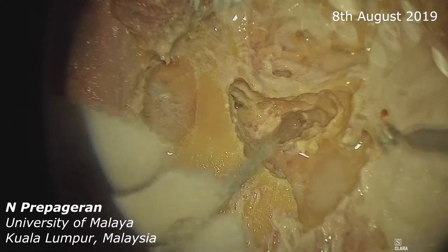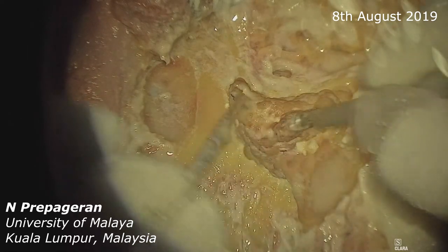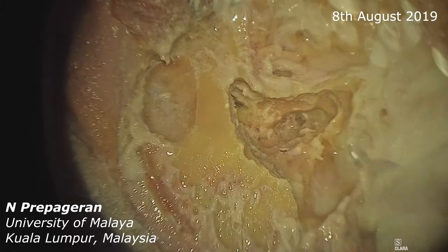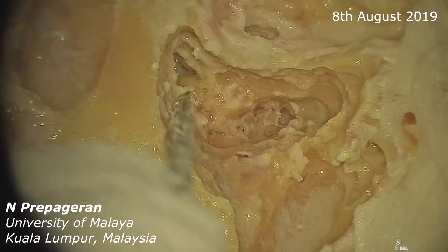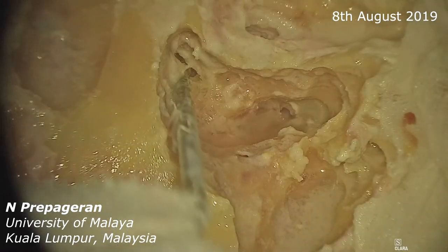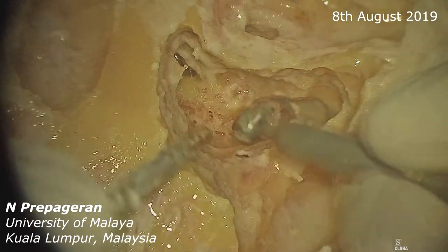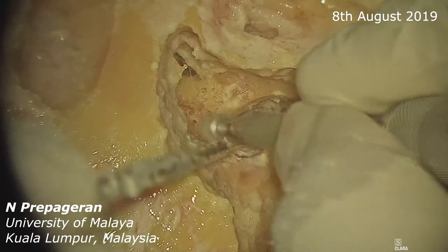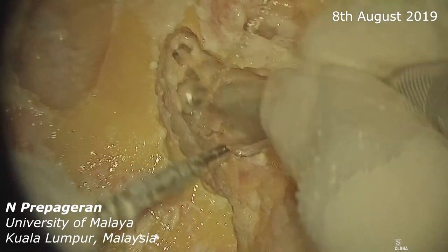So that will give us a landmark to the facial nerve. So with this now, let me go to a higher magnification. I can see now the incus, you can see the lateral semicircular canal, you can see the posterior semicircular canal. So I'm going to now start drilling to expose the middle cranial fossa.